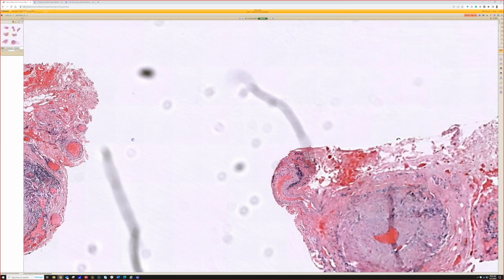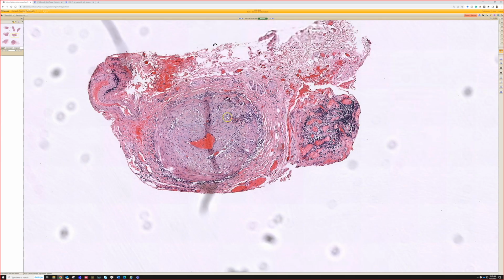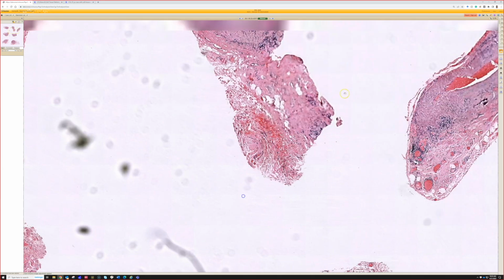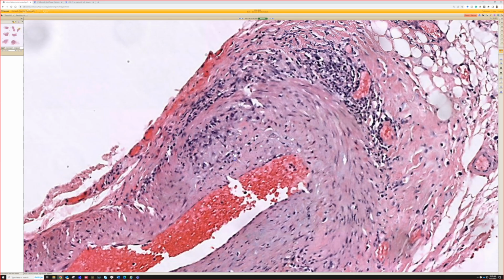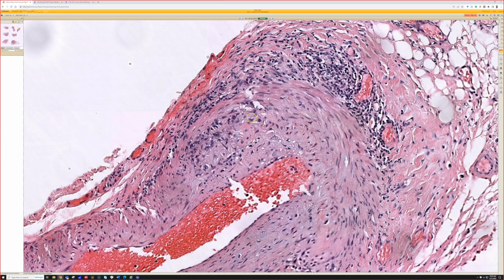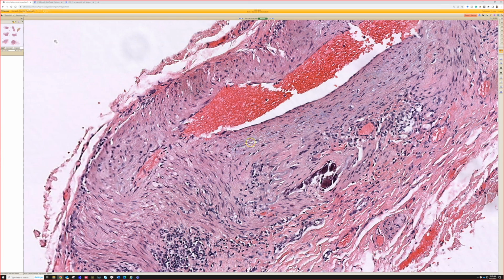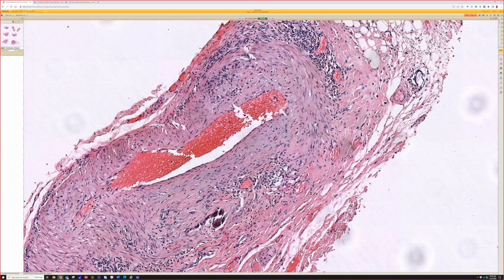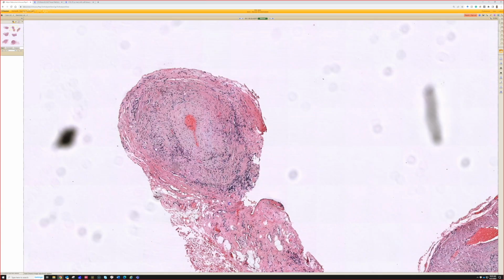You can even see fibrinoid necrosis sometimes in the vessel wall, and sometimes I'll see neutrophils with it even. And the giant cells, we've looked at multiple sections, but only seen a couple of giant cells. The giant cells and histiocytes tend to be hanging out right around the edge where the intima meets the muscular media, where the elastic lamina is, wrapping around that. We usually have to examine multiple deeper sections on these in subtle cases. In this one, one section has a slam dunk diagnosis for us.